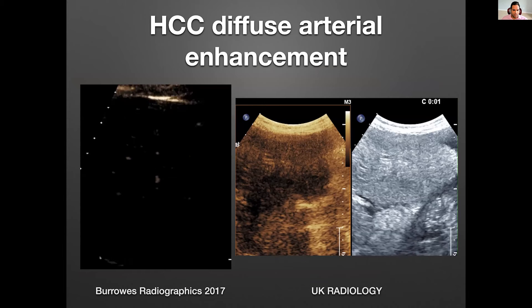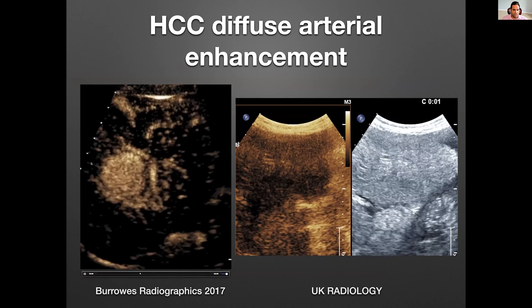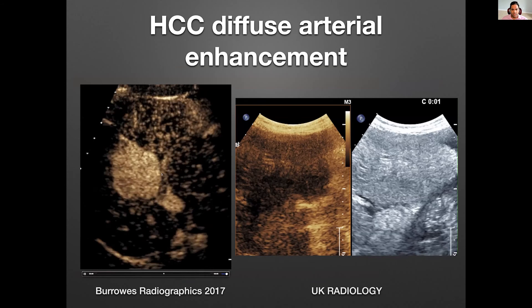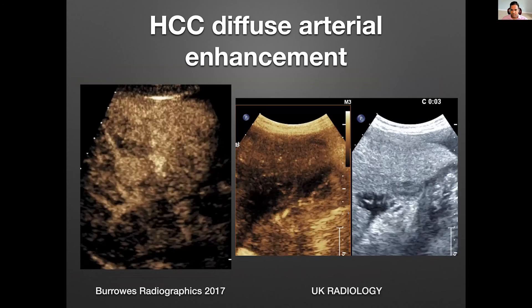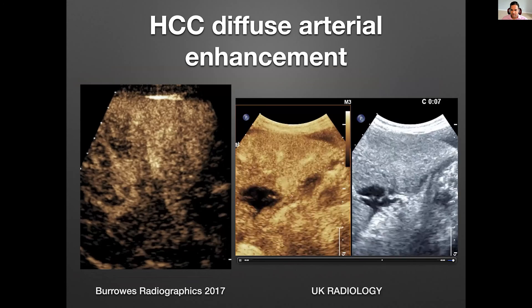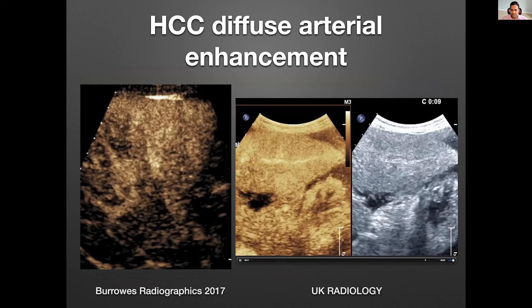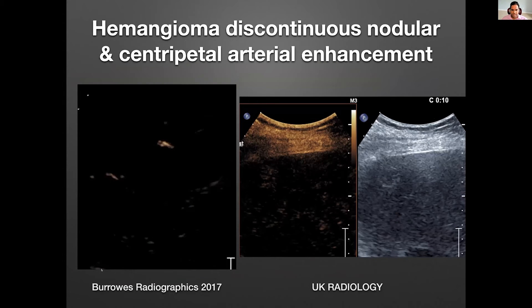Here's a video from the literature showing diffuse arterial enhancement in real time of an HCC — within the first 15 seconds. And a corresponding video from our university showing a similar imaging pattern: the microbubbles are arriving, you can see them in the vessels, and then the lesion avidly enhancing. I like the side-by-side grayscale comparison for publishing and for the sonographer to confirm they're in the right area.